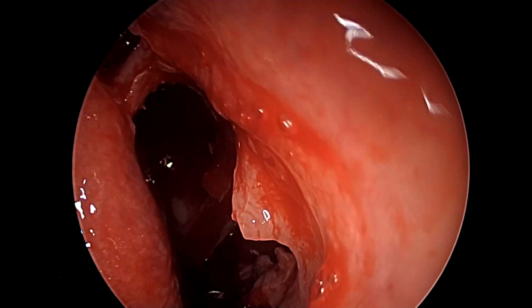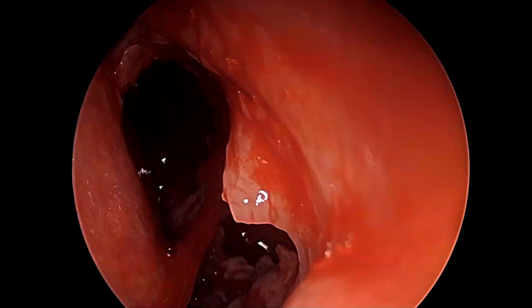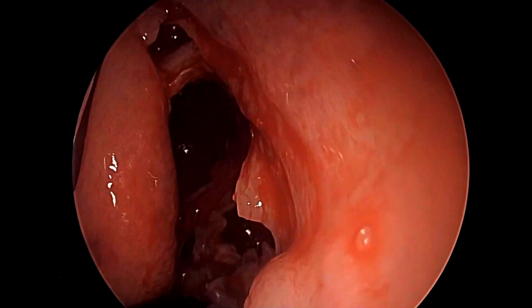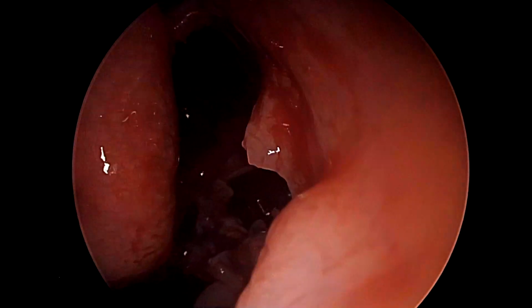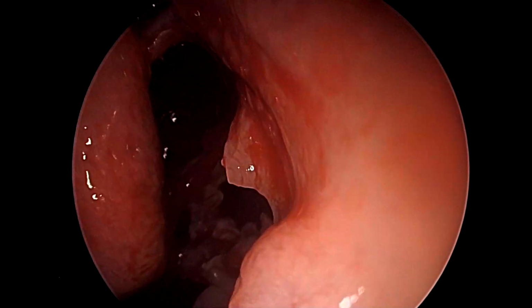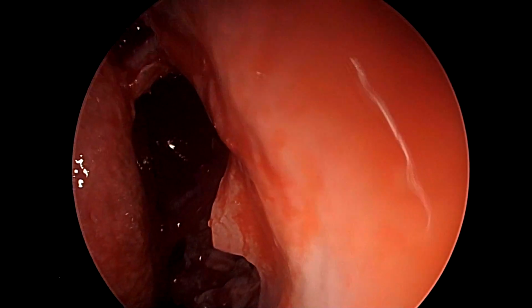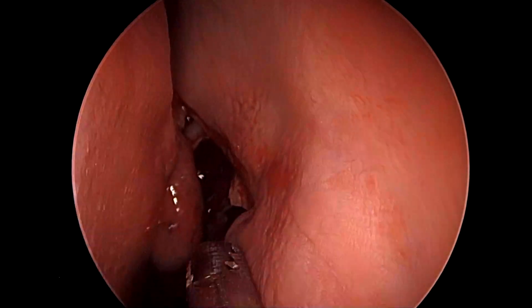Now that we have identified the meningocele right in front of us without having to dissect a lot, the main focus would be to clear the excess redundant mucosa and dissect the cells around, and to create a bed which is both flush as well as raw for acceptance of graft material, whether that is fat or fascia. In this case, we plan for fascia to be used as a reconstruction material.